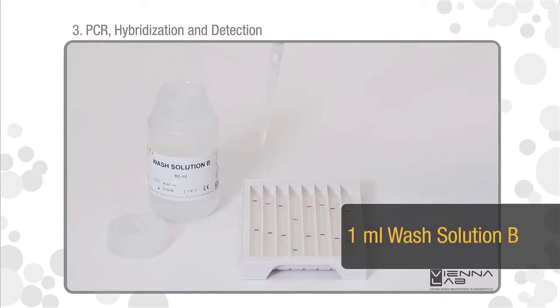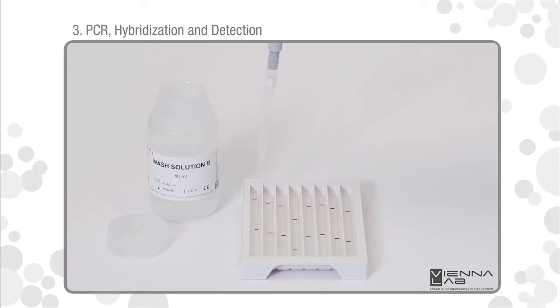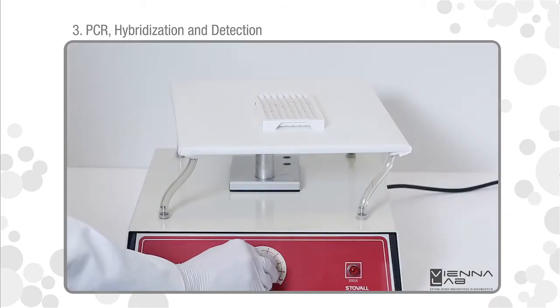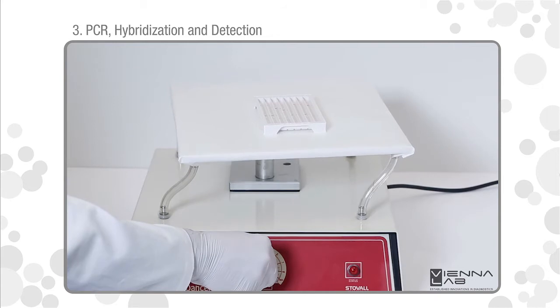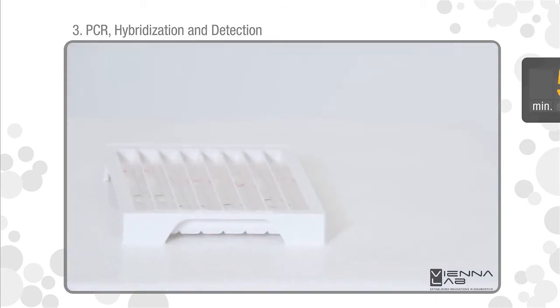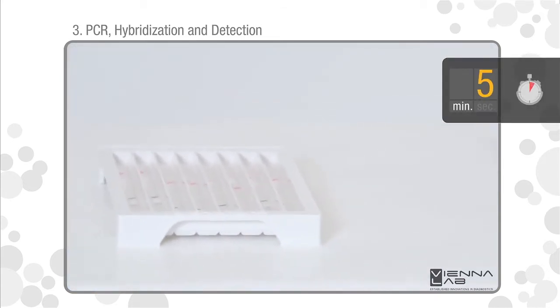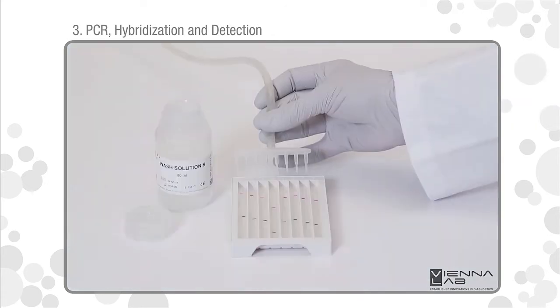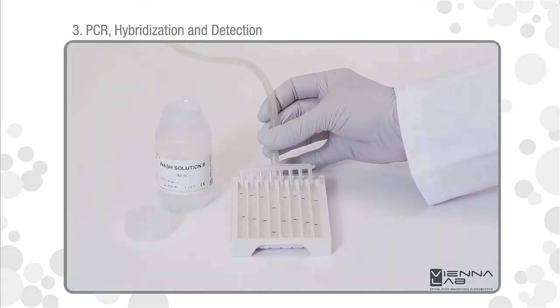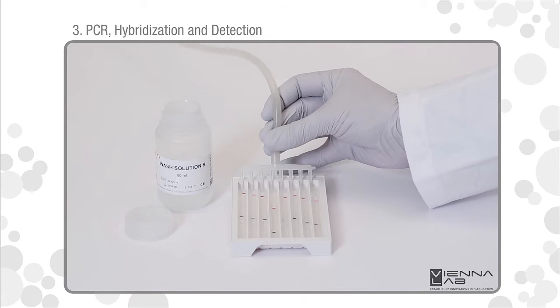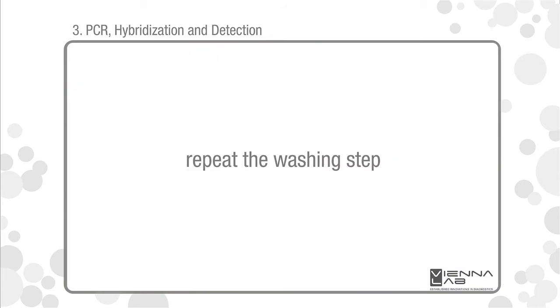Add one milliliter wash solution B. Incubate for 5 minutes at room temperature on a rocker or orbital shaker. Remove liquids by vacuum aspiration. Repeat the washing step.